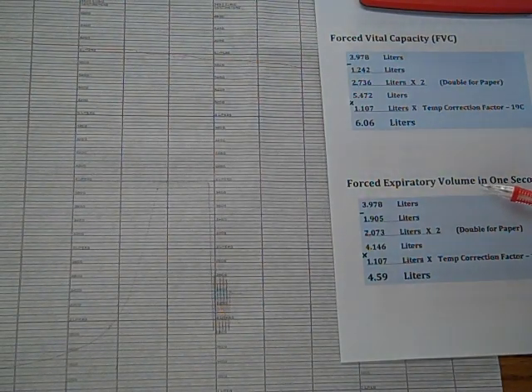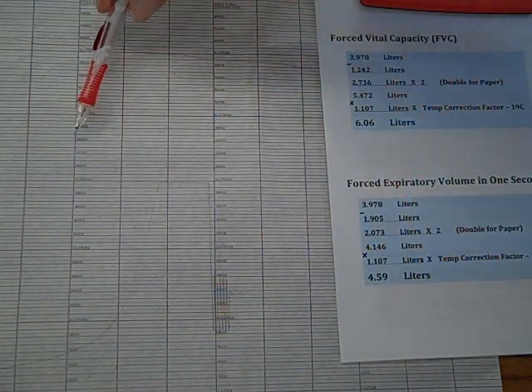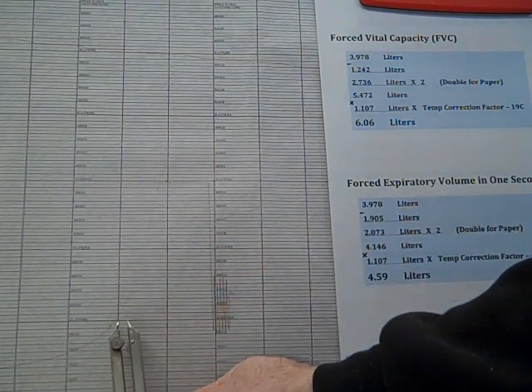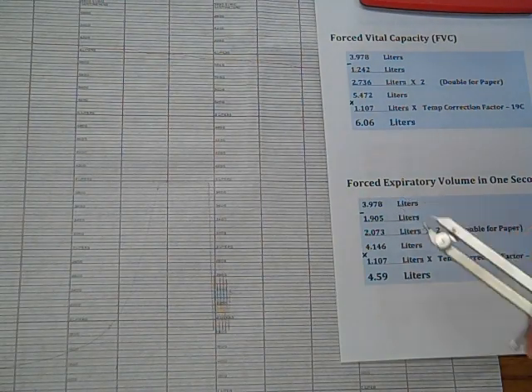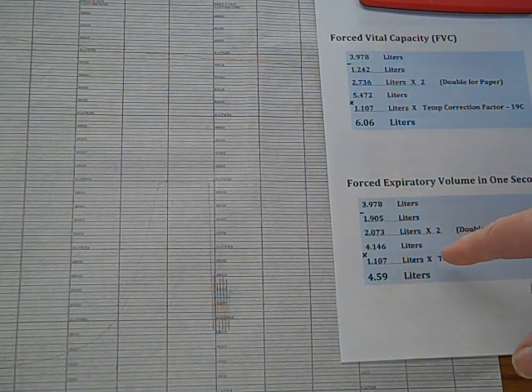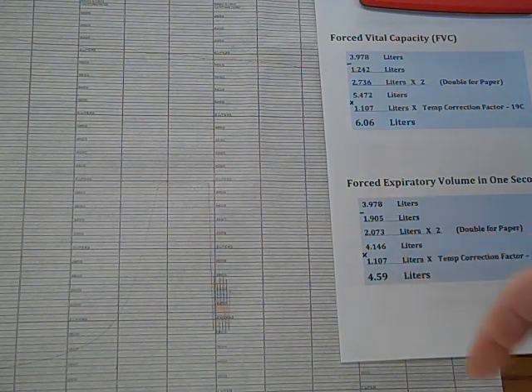The forced expiratory volume in 1 second. Well, as the drum is spinning, each of these lines are 1 second apart. And to get in 1 second from the initial exhalation, we would measure the distance from this line and add it over here to the other side and measure from that point. And when we did that, 3.978 liters was the start of the exhalation, and in 1 second, they were at 1.905. Again, we double for the paper, and we multiply by the temperature conversion, and we ended up with 4.59 liters.